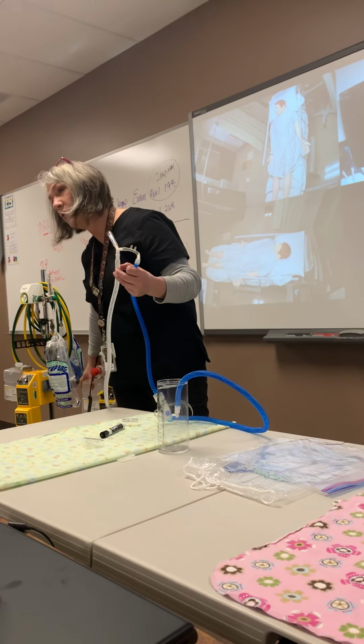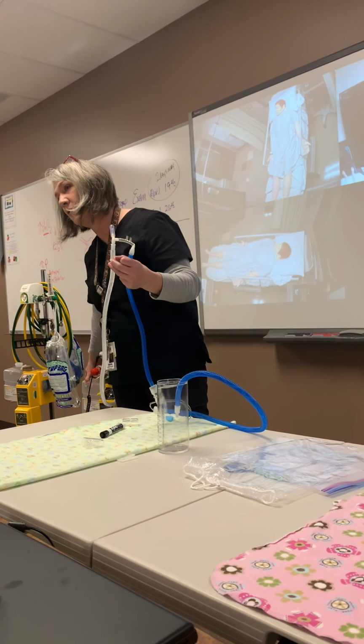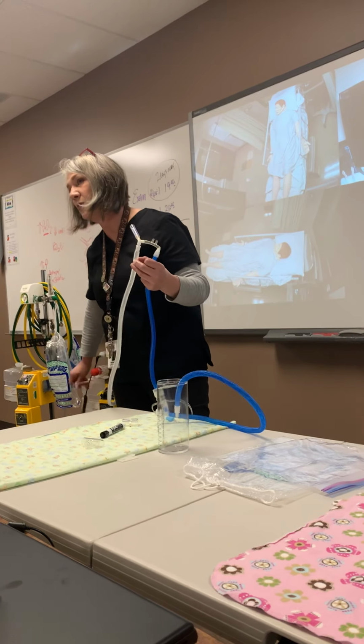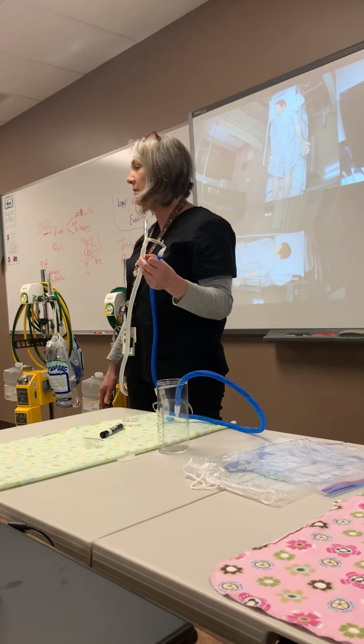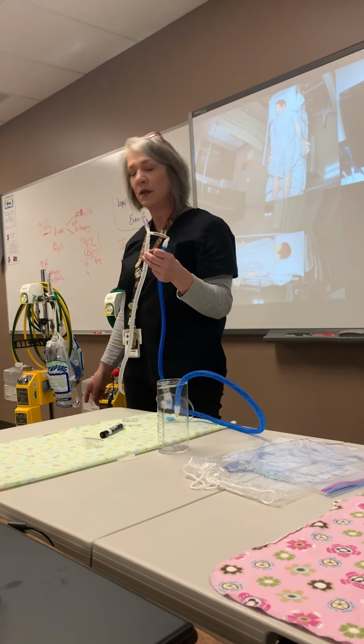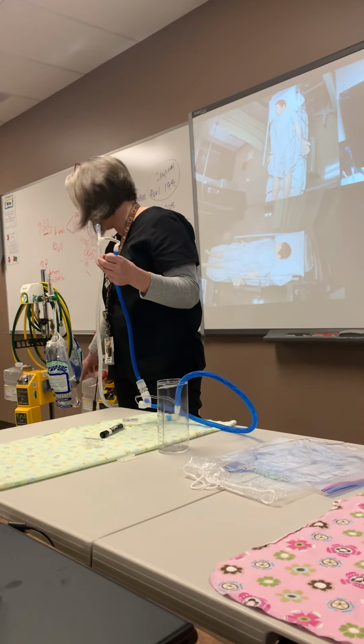Another thing that will cause you to have an issue with your system is if you have these open. Let's say this one's off, now I have a big leak again. So I always think if something's not working, you have a leak somewhere. So then just troubleshoot to see where your leak might be.